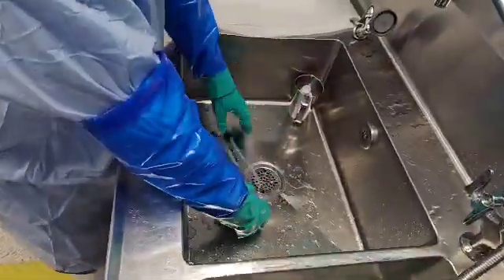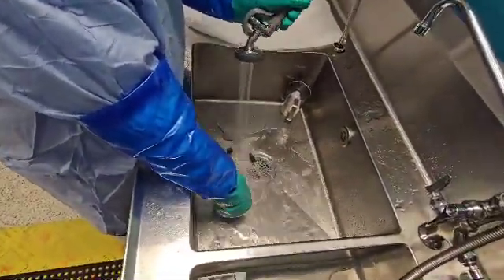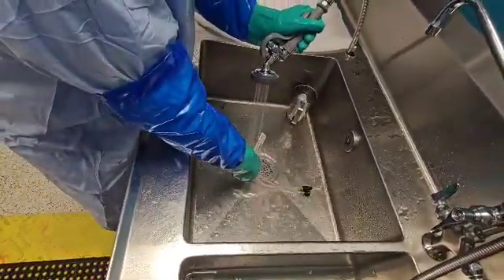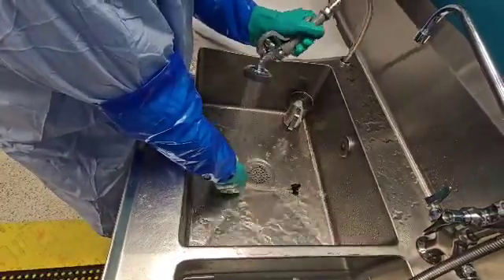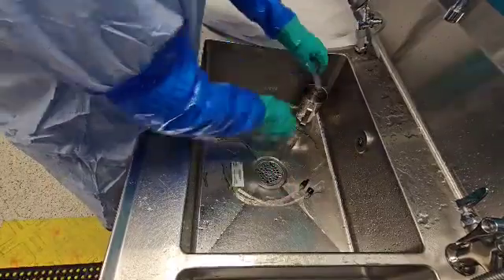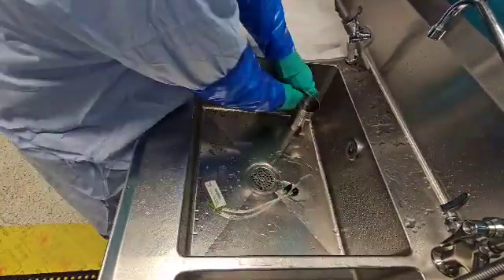Next, we want to go ahead and rinse our device with some treated water — externally and, more importantly, internally. If you have a connector that you can attach to this tube to rinse internally with treated water, that'd be great. I have a syringe that does the trick just fine.